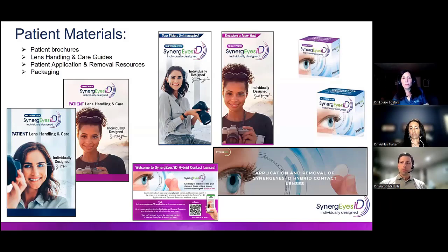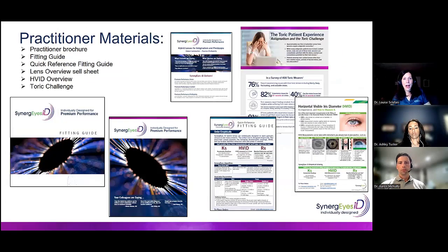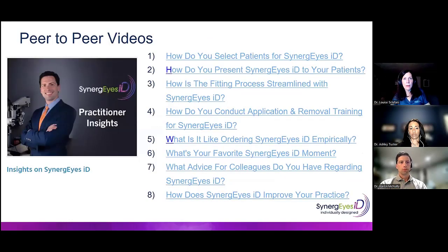Dr. Tucker mentioned several different methods, including the tripod. You could use a DMV if you'd like to. You could use a ring inserter. And then for removal, you either use your fingers or a tissue. So keep that in mind. There are a lot of patient materials, including how to take a good HVID measurement. And again, in that chat there is some information in that space. We have some great peer-to-peer videos showing why they are successful, and some insights on using the SynergEyes ID lens.